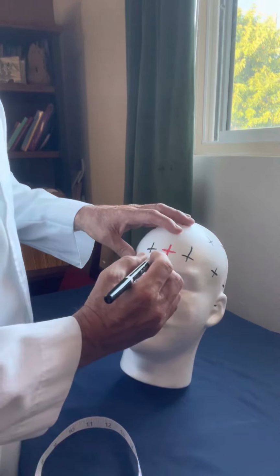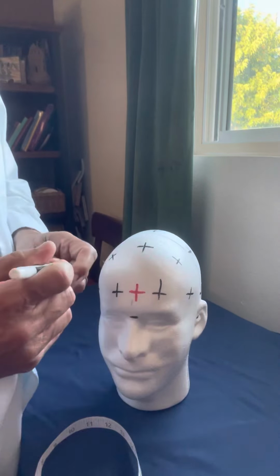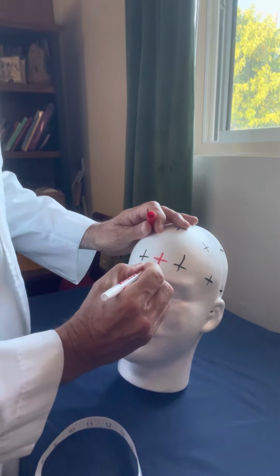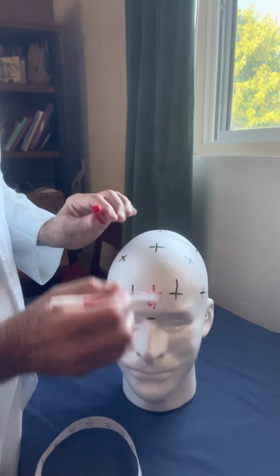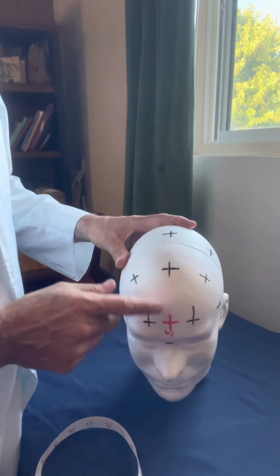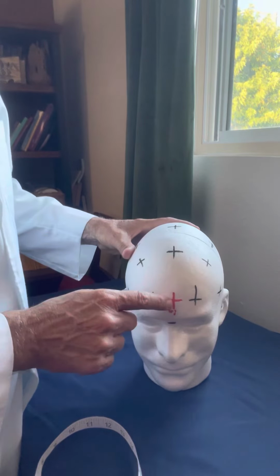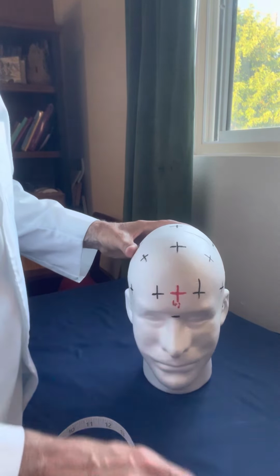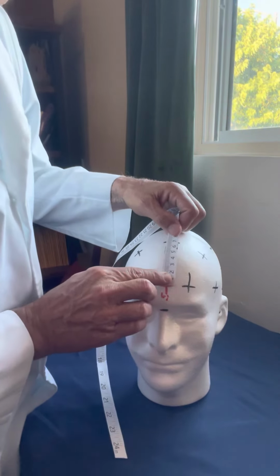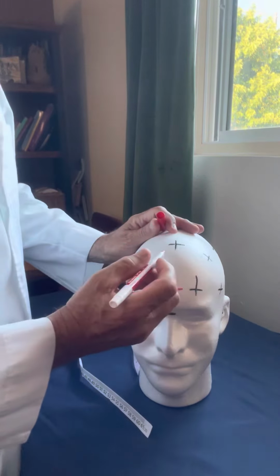So it's 10% of the nasion to inion distance. From FPZ to FZ, that's 20% of the nasion to inion distance. So 20% would be 7 centimeters. Let's see what that is. If I measure that, it's 6.8. Okay, so almost 7. So that's pretty close.